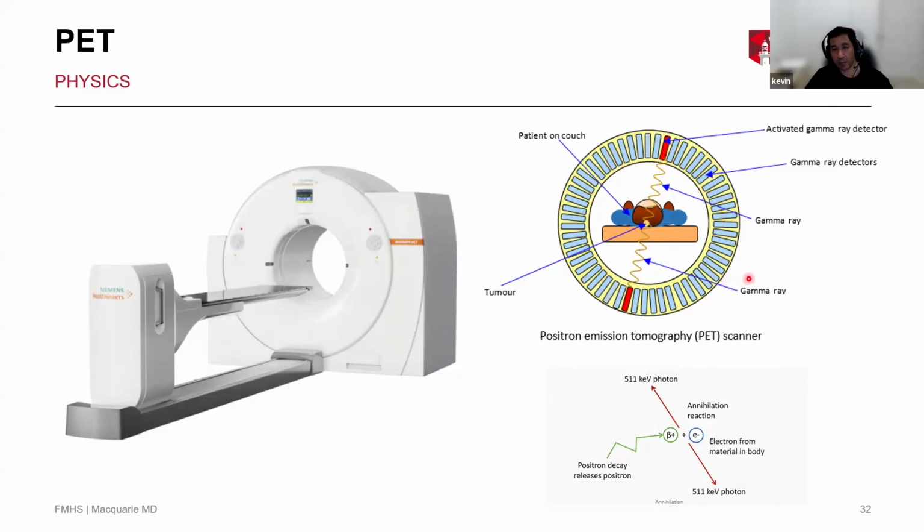Now, the problem is there's attenuation of the radiation. Firstly, as these photons move through the body, they get partly absorbed by the body, which means that the skin gets overrepresented. Now, if you look at the images from the old-fashioned PET scanners many, many years ago, they all look like, remember the Michelin Man? They really look like bubble people, okay? Because the skin was overrepresented.